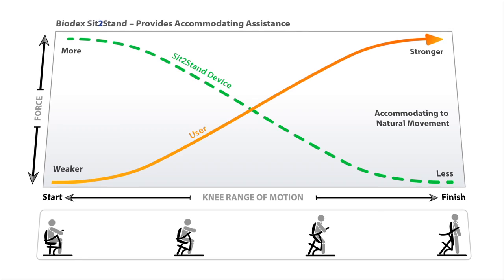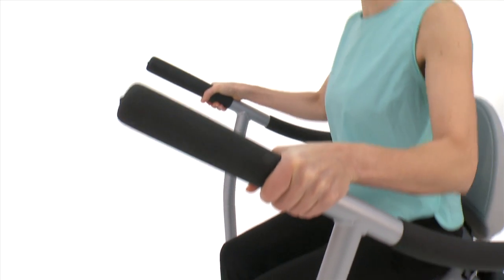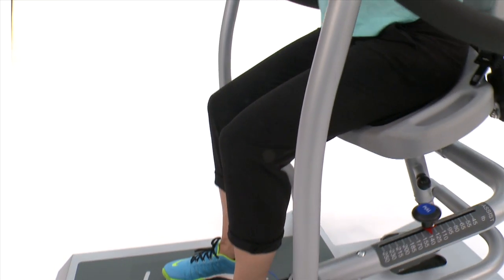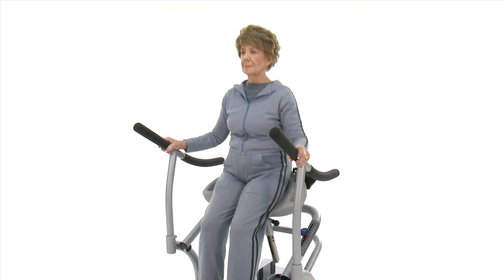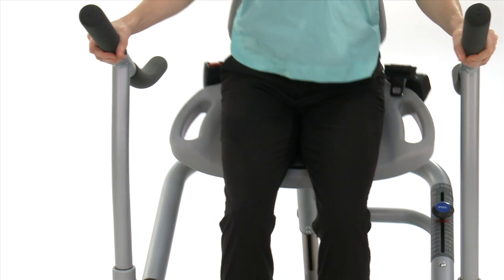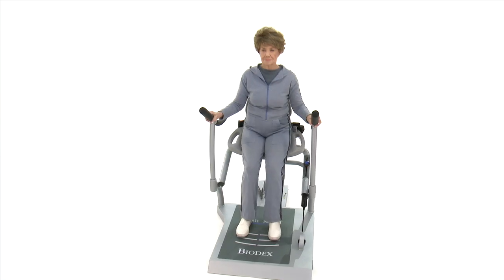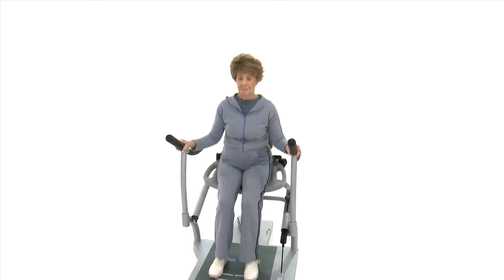The unique assistance technology can perfectly accommodate slow or fast movement. Even older adults can safely and comfortably perform plyometric-type movements, engaging the fast-twitch muscle fiber that helps maintain or improve strength and, even more importantly, muscular power.